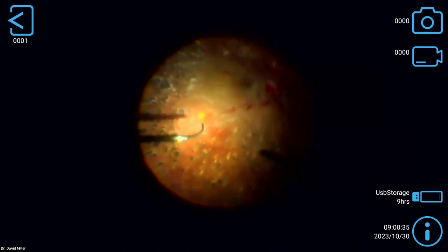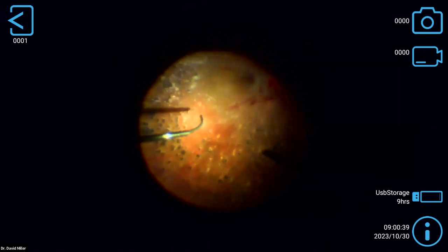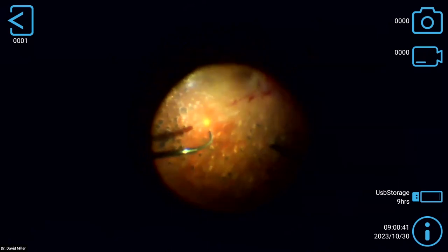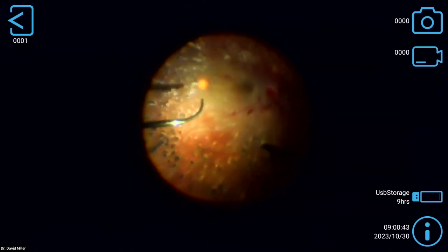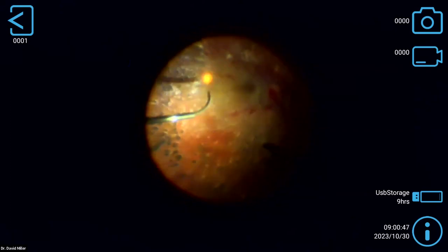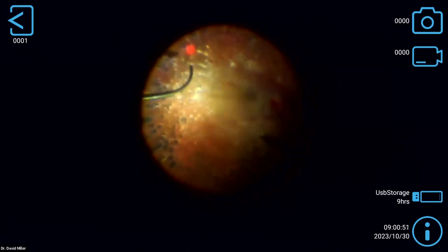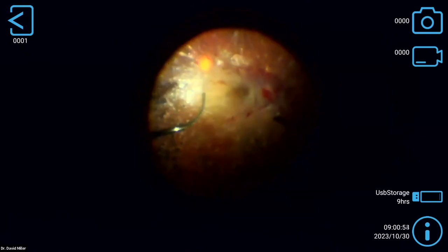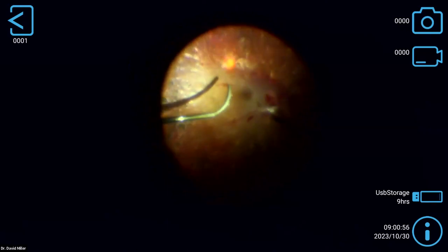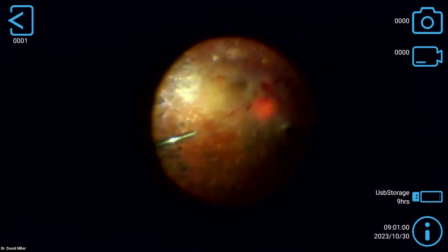And I will just make comments about this case. You see me lasering kind of close to the macula, perhaps, but look at these vessels. They're completely white. This is, you know, non-viable retina. Anyhow, it's ischemic. And we're better off just lasering it off. It'll probably help long-term with diabetic macular edema, also prevent anterior segment neovascularization. Patient already had pretty good PRP in place. So you're seeing a lot of old pigmented scars too. We're going to stop there.